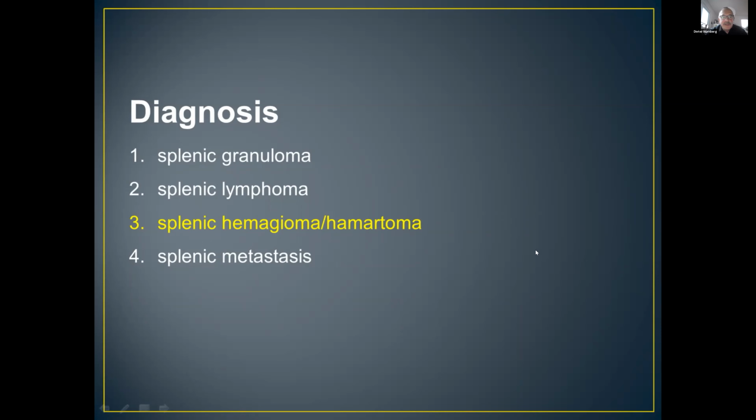The question is, can it be a hydatid cyst? No, a hydatid cyst is non-enhancing. Not enhancing of the walls, not enhancing of the content of the cysts. It's completely unenhancing. At CEUS, it seems to be simple cysts. Okay.